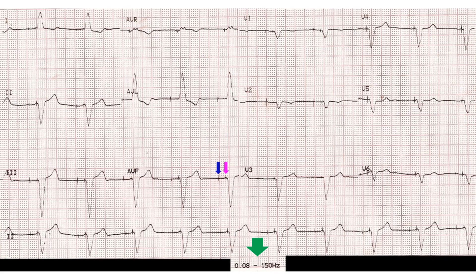The paced P waves are of low amplitude and hardly visible, or it could be lack of atrial response to atrial pacing — atrial capture failure.